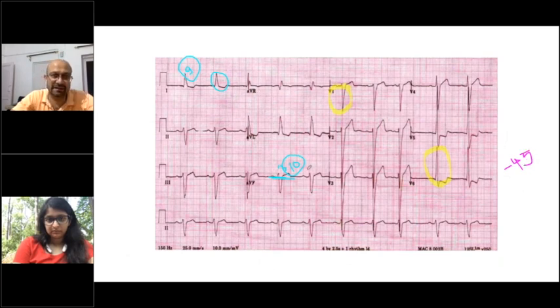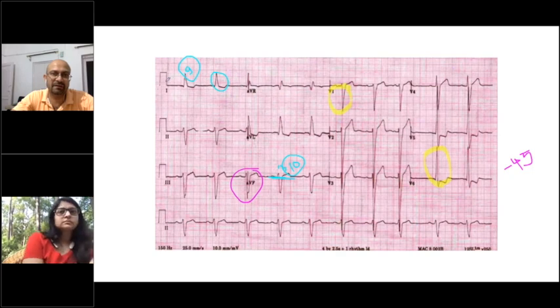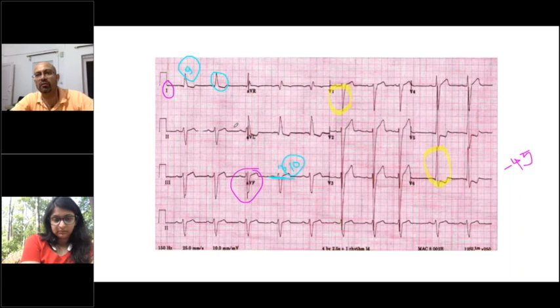So it's the easiest thing to do. If you have a graph paper in your mind, find the resultant in AVF, find the resultant in 1, and just make those two vectors, make a resultant vector, and you will always get the right number.